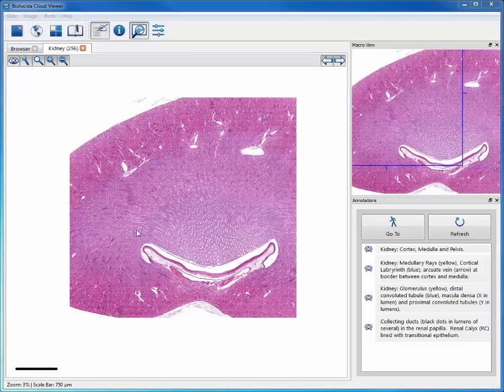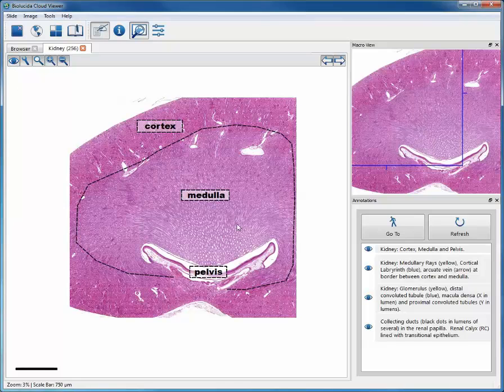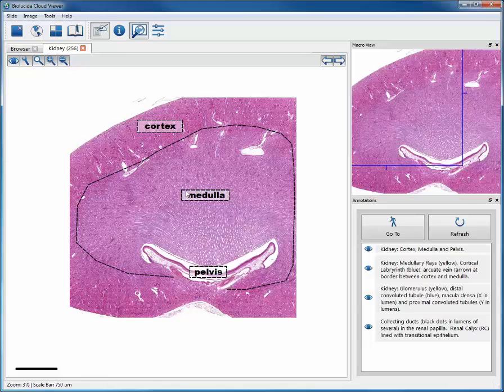If we turn on the annotation for this particular level of magnification, you can see the kidney is divided into a cortex, medulla, and then of course the pelvis.